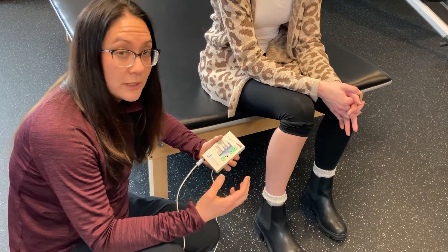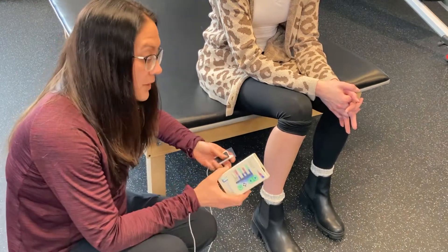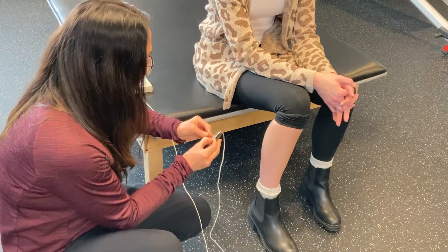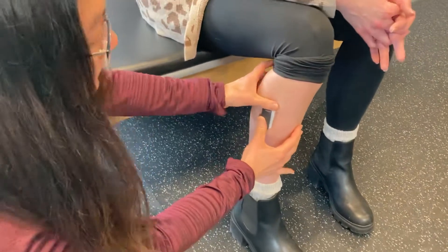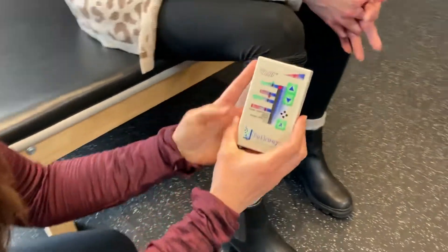This is really important for balance and dynamic function. So a lot of times what we will do is take the biofeedback — it's a little handheld unit — and I am going to stick this sticky patch on Sassy's leg right in the muscle belly, and then we'll turn it on.